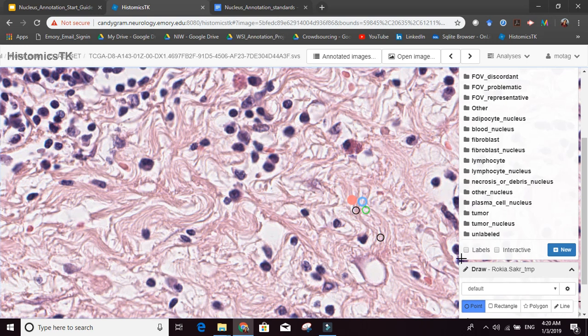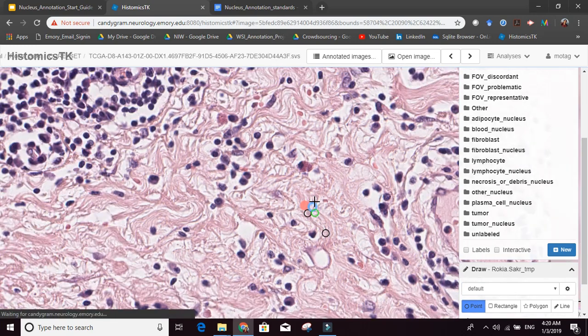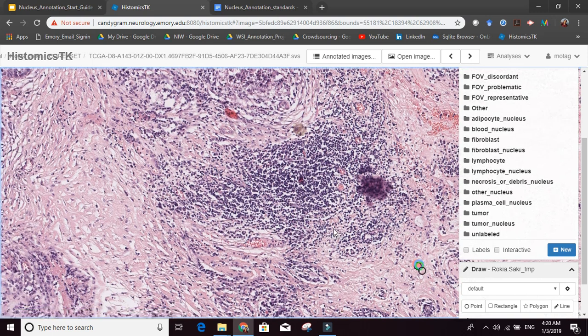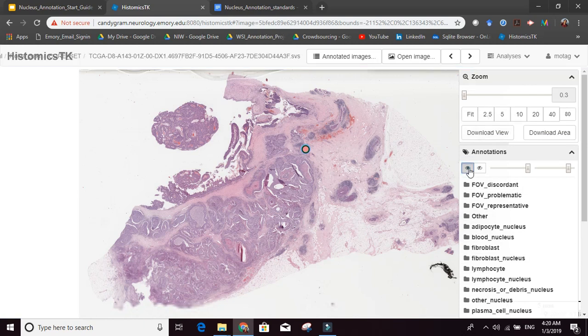So after you do this and you define everything in here, all the styles, and you place a dot for every style, now you are ready to actually do some annotations. So you zoom out completely, and then you can see where we place all the dots in here. Then you click the eye icon so you can see your fields of views and corrections and whatnot. Now just wait a little bit for everything to load. All right, let's wait. We have nothing to lose.